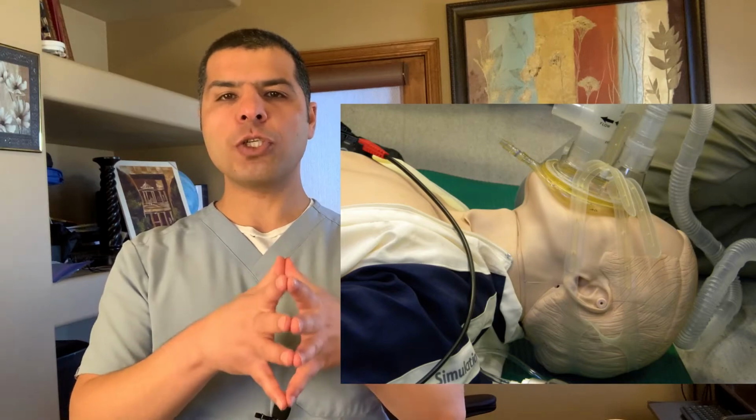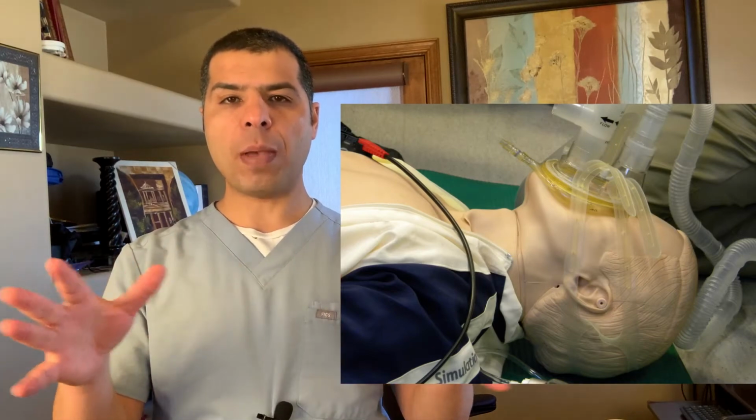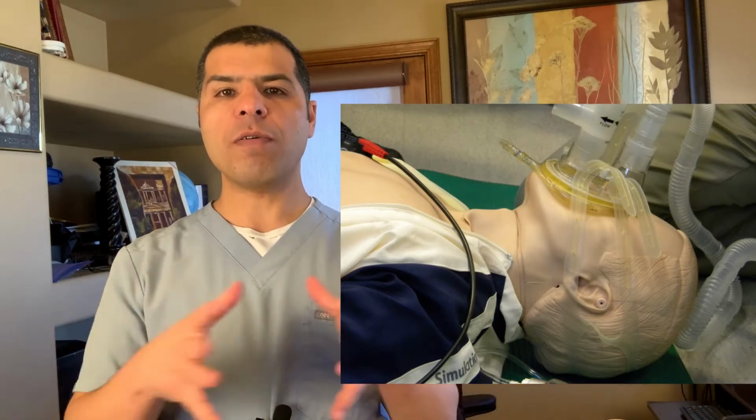Meanwhile, the patient continues to be in maximum oxygenation, 100% FiO2 through the CPAP. We have not removed him off the CPAP so far. I also inform the respiratory therapist to make sure the stylet is inserted in the ET tube and it's properly inserted. I have my suction Yankauer ready to use. I have an introducer, the bougie catheter, in case I need it. And I made sure that I have all the tools needed.